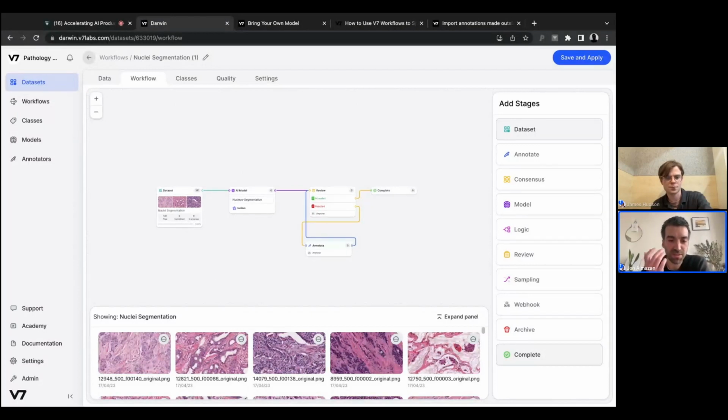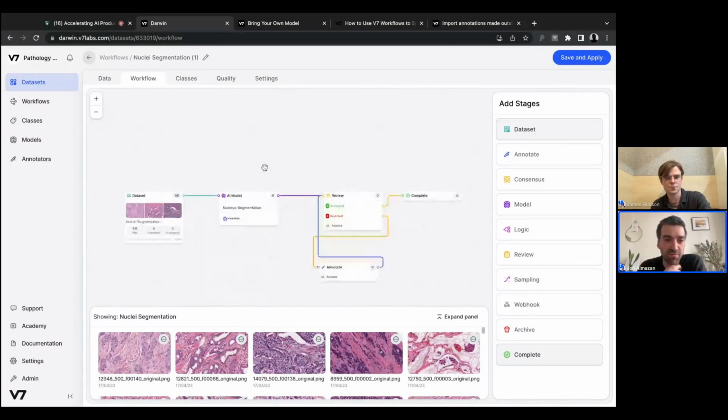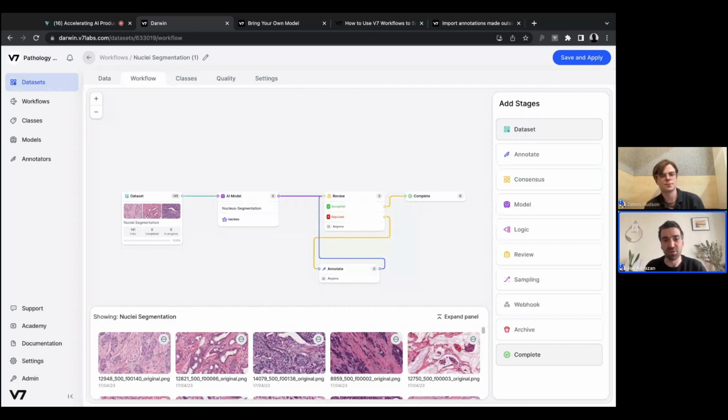We know that some of the challenges we typically have with this kind of data is having really large images, and this is always challenging for training models, because when inputting these really high resolution images to a model, in some cases you have to rescale so you lose a lot of information, or you don't have enough RAM or memory to actually run these models. The same happens for inference, so you cannot do an inference call to a model whenever you have images that are gigabytes in size. So for that, we also provide a couple of workarounds.